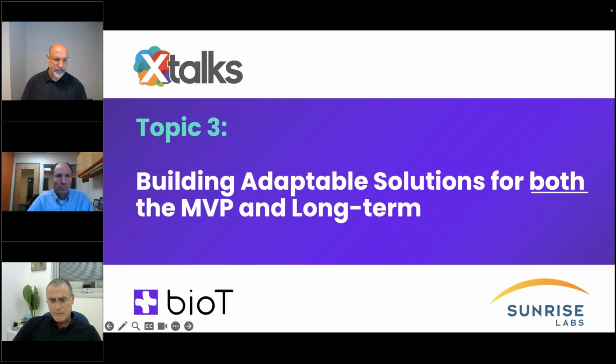The second point, when it comes to privacy and also cybersecurity, is how do you now handle all the different regulation and compliance aspects that are coming from the care providers? So it also depends on geography. In some cases, care providers in Europe are asking for ISO 27001 as compliance for security. In the US, it's mainly SOC 2, and now moving to HITRUST. So you need to be aware of the different elements that can come up with cybersecurity requirements from this side, and make sure that you have a plan on how to address them and support them.